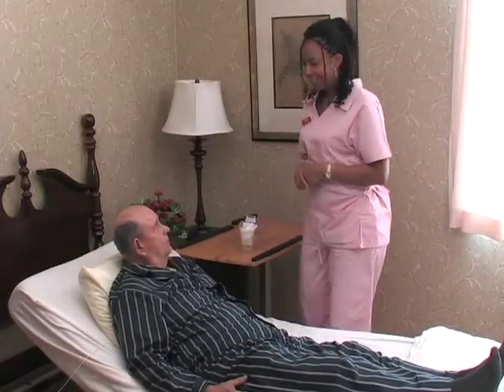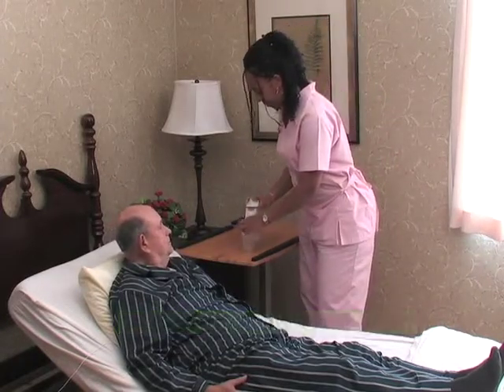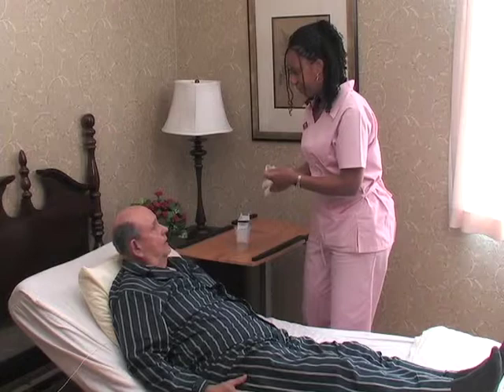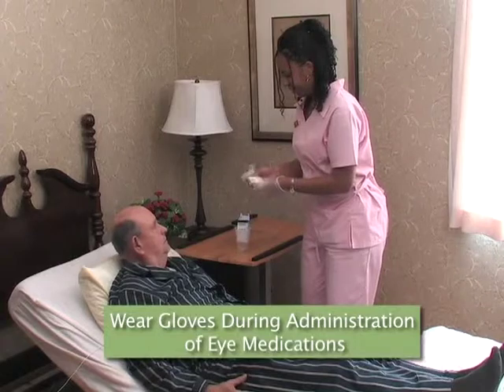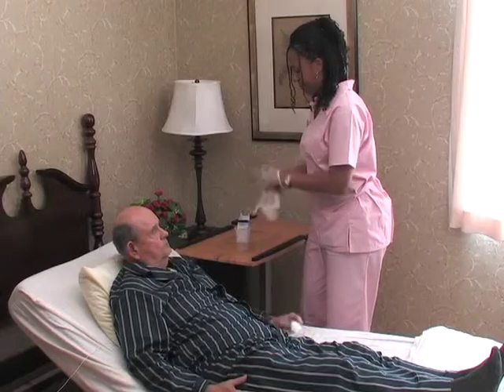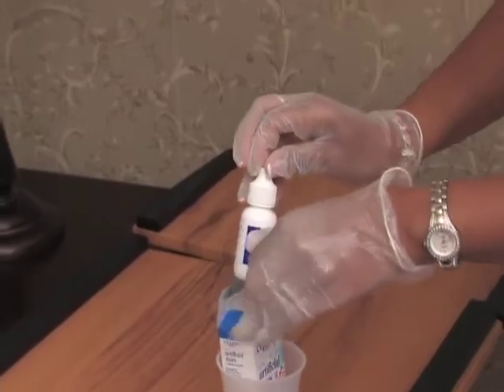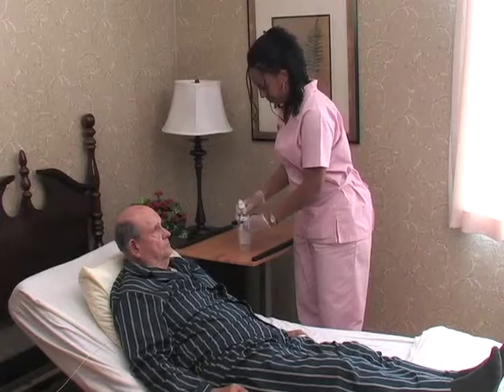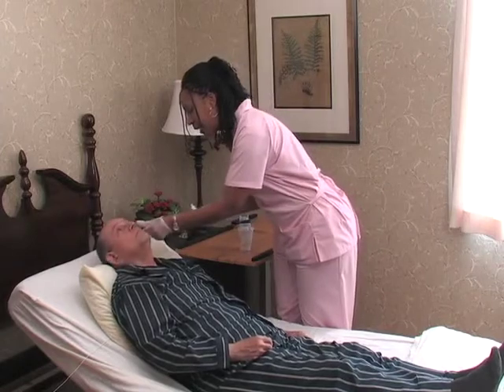Hello, Jerry. How are you today? Good. Can you verify your last name for me? Hanson. I have your eye drops. Oh, good. Do you remember how to do this? Yes, I tilt my head back. Okay. I have tissue for you also. Oh, okay. There you go. Thank you. Okay, can you tilt your head back for me? Okay, I'm going to pull down your eyelid.